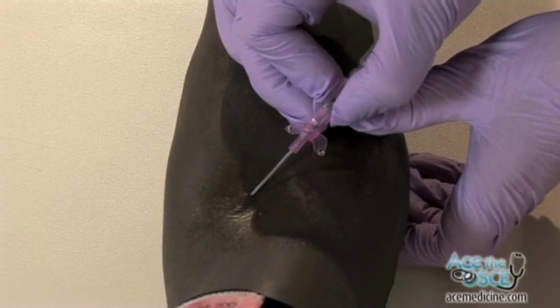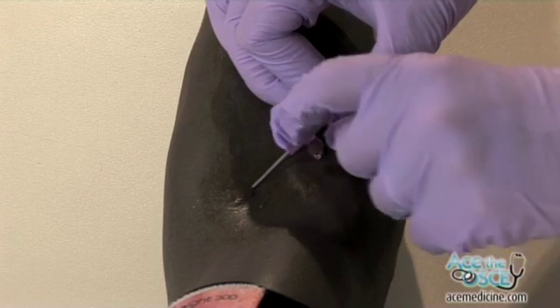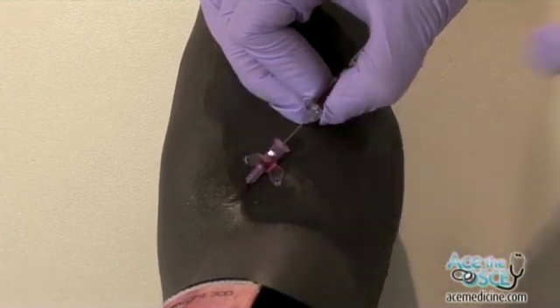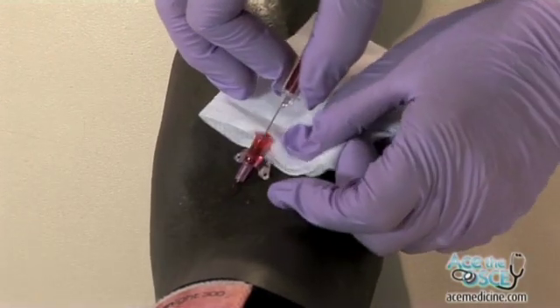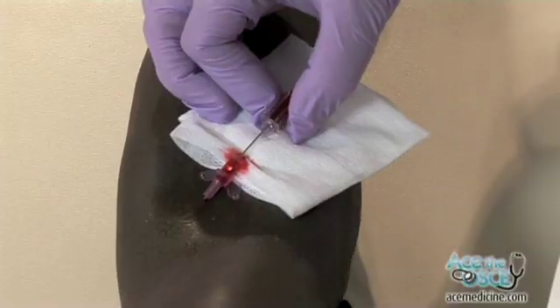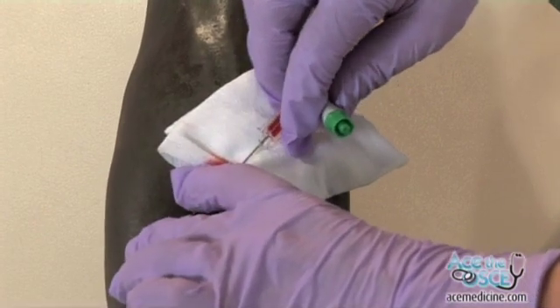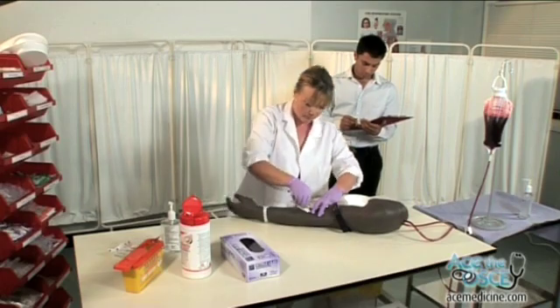Insert the cannula into the vein at a 30-degree angle and watch for a flashback. Keeping the needle holder steady, insert the cannula plastic into the vein. Place gauze under the cannula to catch any spilled blood. Remove the tourniquet. Apply pressure over the vein to minimize blood spillage and withdraw the needle. Immediately place the needle into the sharps box.